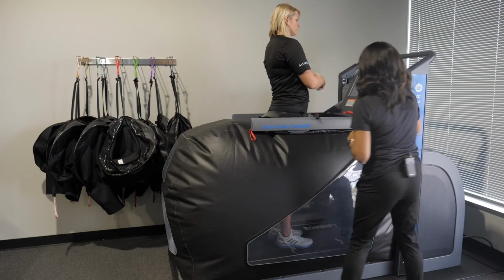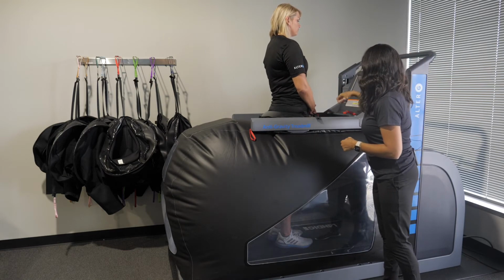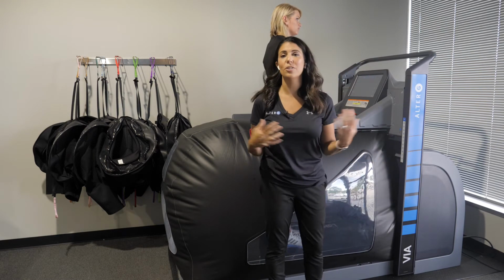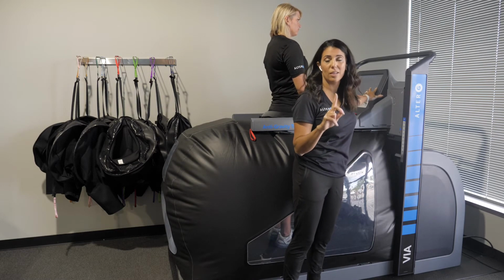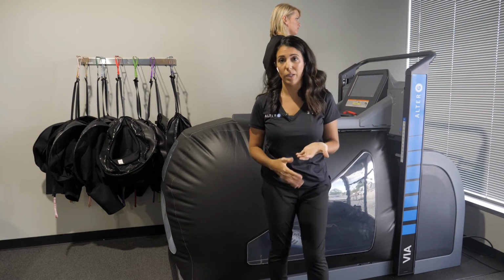All right. So calibration's complete, so we're going to start the session. Once I press start session, I can now change any parameters that I want. I'm going to start by unweighting Katie so that she's in a fall safe environment. Again, one of the key features of the AlterG is that I can unweight in 1% increments, so I can be so specific when I'm unloading or progressively loading a patient.